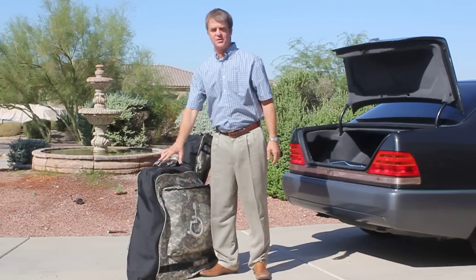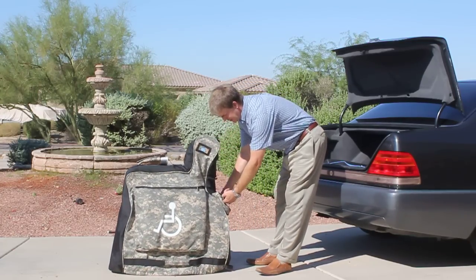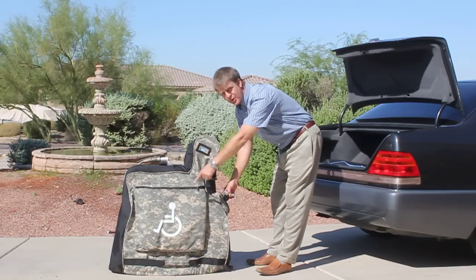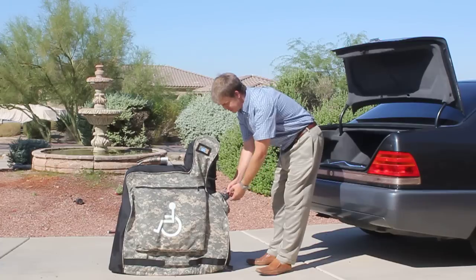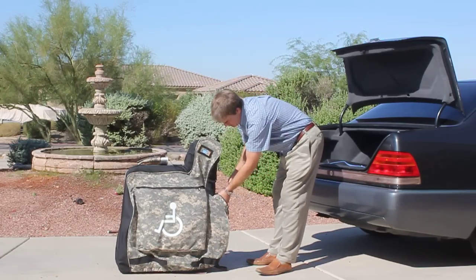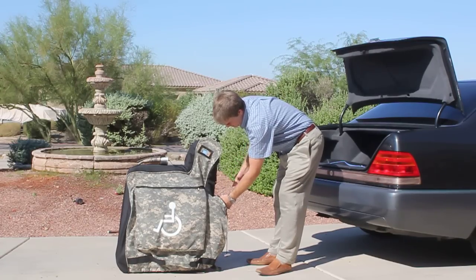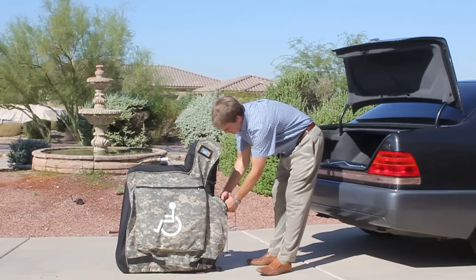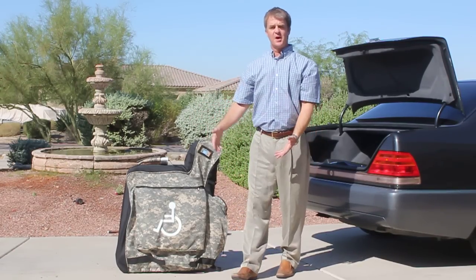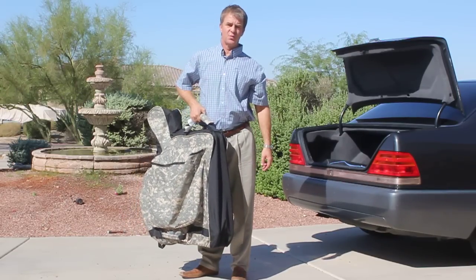And it drops all the way down. Make sure the front completely covers the front rollers. Then on the back, we have two specially made rope clutches, which work off of 1,000-pound rock climbing rope, which runs all the way down the bottom, all the way back. It works kind of like a drawstring on a purse. Grab one rope clutch, give it a pull. Grab the other rope clutch. What it does is make a smaller space around the bottom of the wheelchair, so that the wheelchair can't fall out. Now our wheelchair is completely encased in the wheelchair carrying case.